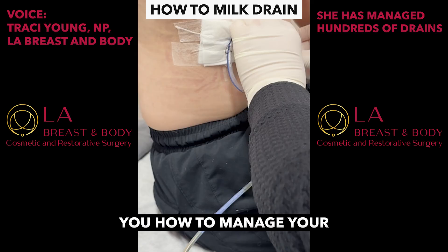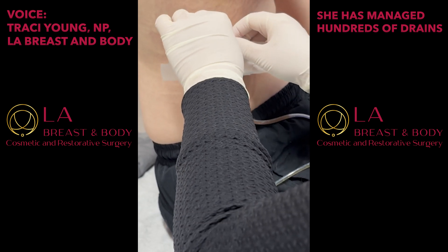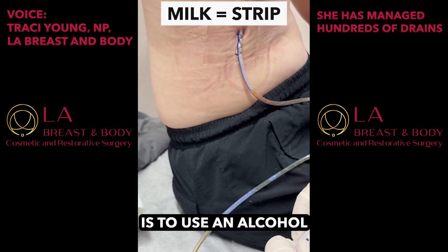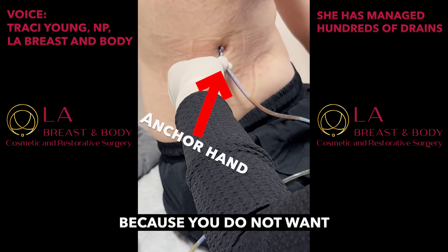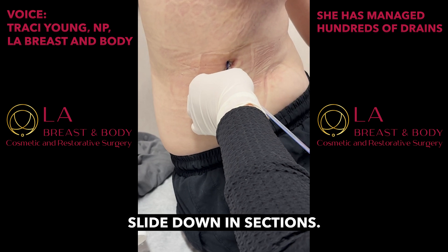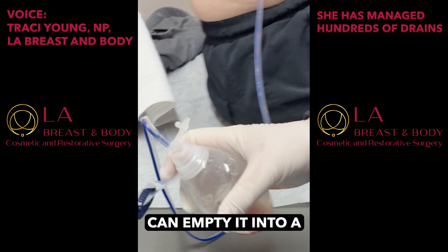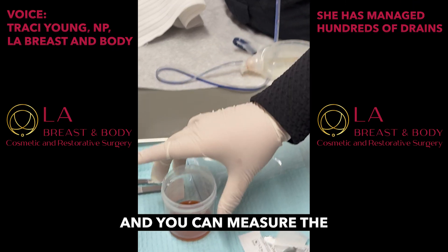Today we're going to show you how to manage your drain. We're going to take the dressings off first. When doing this at home, wash your hands with soap and water — you don't need to wear gloves, just make sure your hands are clean. The easiest thing to do to milk the drain tube is to use an alcohol swab. Keep one hand anchoring the part of the tube closer to the person so that it never moves — you don't want to pull on the stitch, that will be painful. Wrap the alcohol swab around the drain tube and slide down in sections, moving your anchor hand along as you go. Once the tube is stripped, take off the section cap to empty it into a measuring cup, then compress the drain bulb and measure the output.